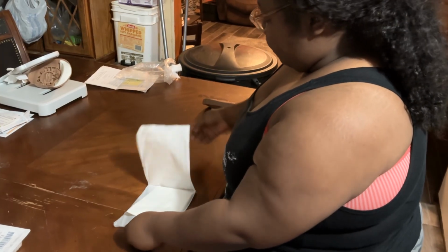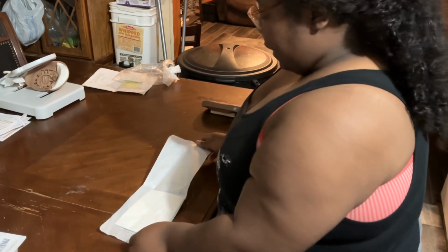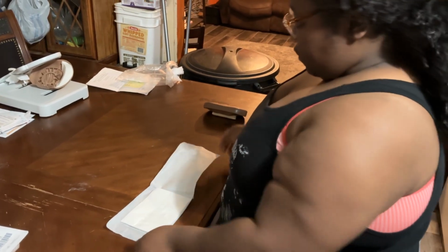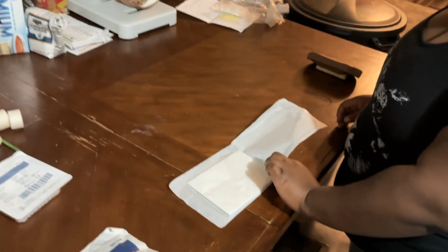I'm careful with my 1-inch border. I'm opening it away from my body. Alright. So I'm going to touch this using my 1-inch border.